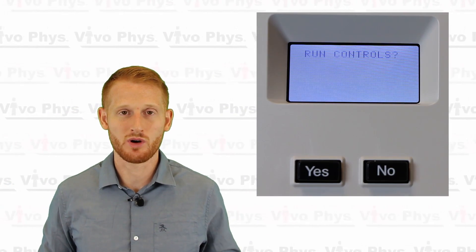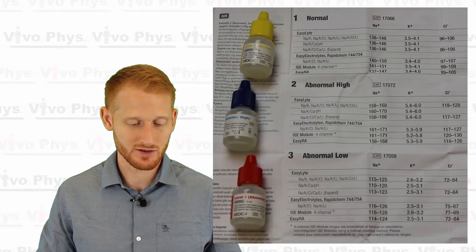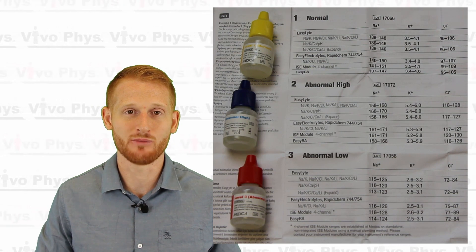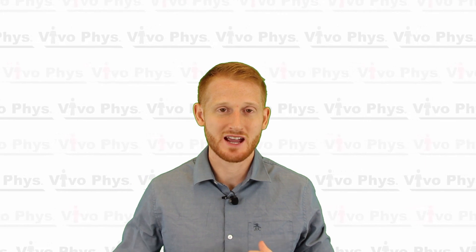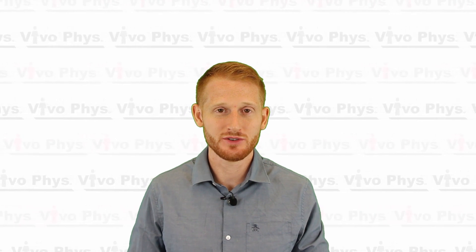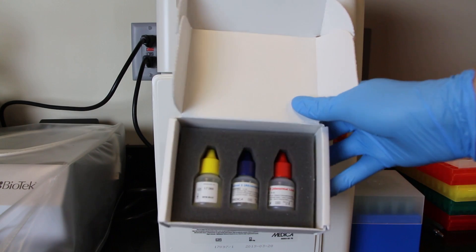You're going to have to run three different quality controls: a normal quality control first, then an abnormally high quality control, and then an abnormally low quality control. The quality control samples are stored inside the refrigerator near the analyzer because they have to be refrigerated when not in use. Take the quality control samples out — whichever one it's asking for at the moment.